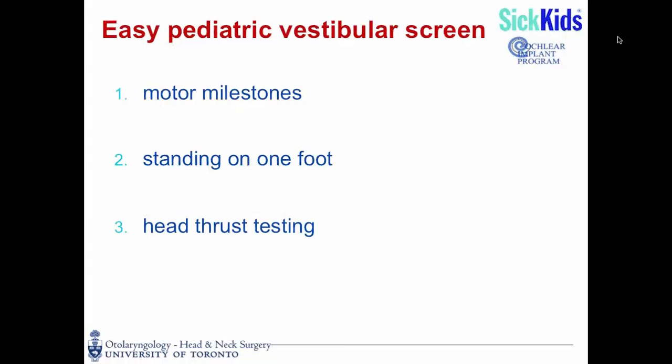So let's start off with what we've termed the easy pediatric vestibular screen. I have a number of colleagues who are pediatric otologists who run very busy clinics. And we thought about what it is that we could ask of them to screen for in the clinic when they're seeing children with hearing loss or dizziness or other otologic complaints. And this is what we came up with.